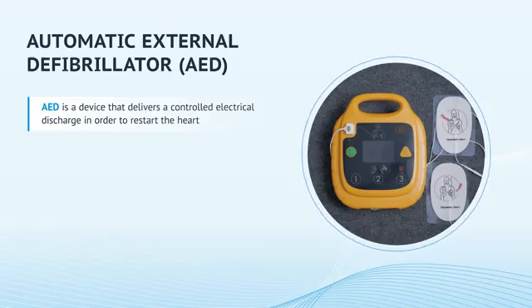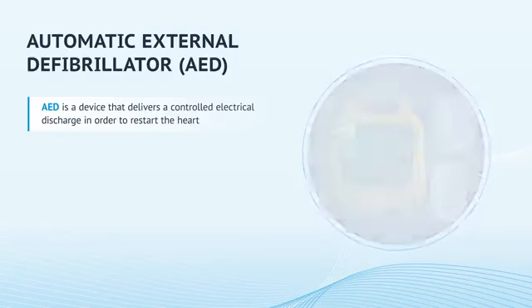And remember, early defibrillation within 3-5 minutes from the development of the cardiac arrest allows the victim to survive in 50–70% of cases. Of course, it is not always possible to use the AED. So if there is no one around, you must follow the CPR actions that we examined in the last video.